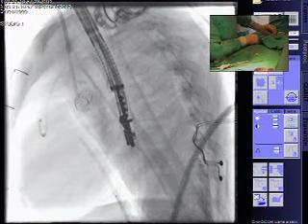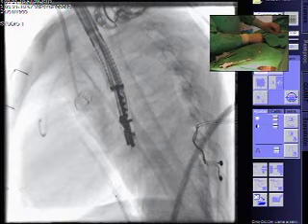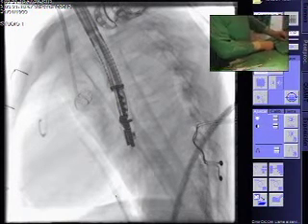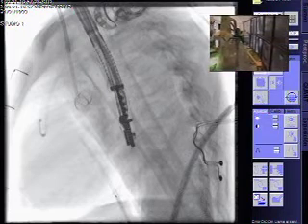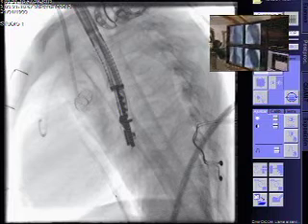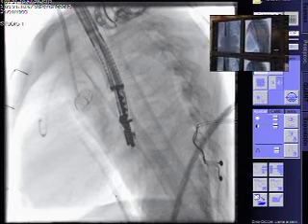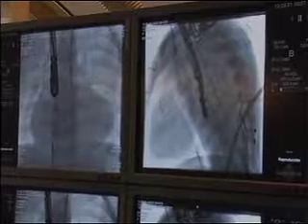Let me show you both PA and lateral views. Podemos ver las dos imágenes? Girad por favor la pantalla. We can see your lateral. Yes, these are the images. Aquí. Yes, las dos de arriba, both on the top.